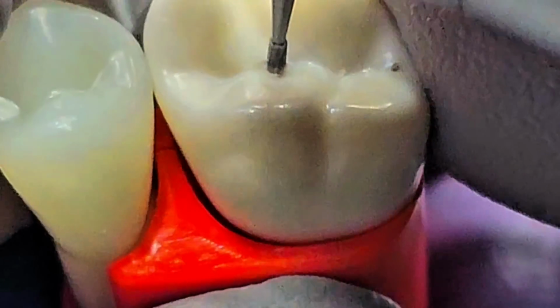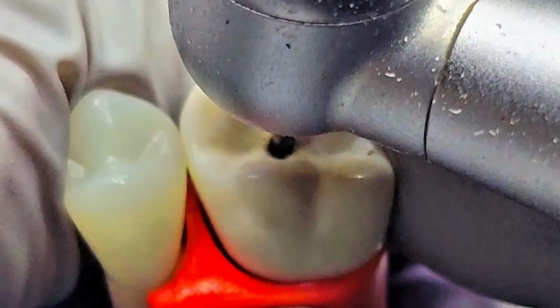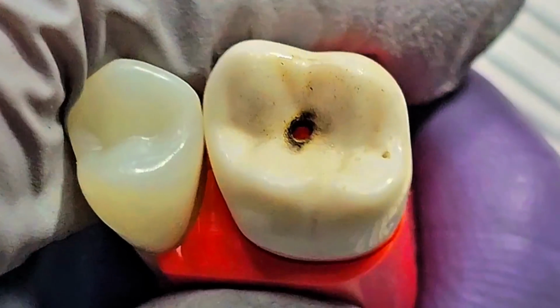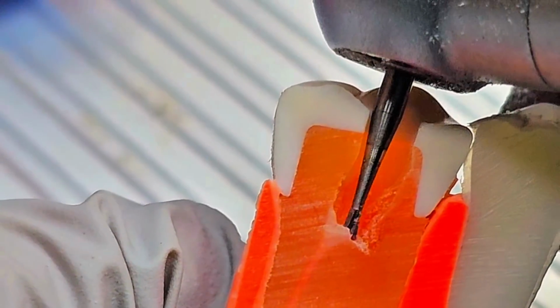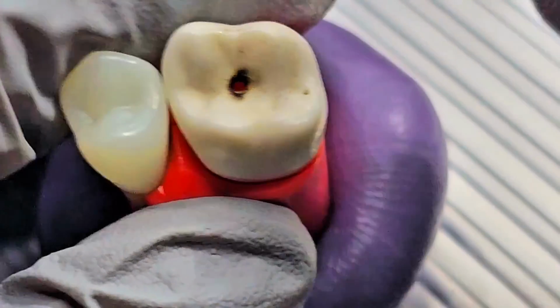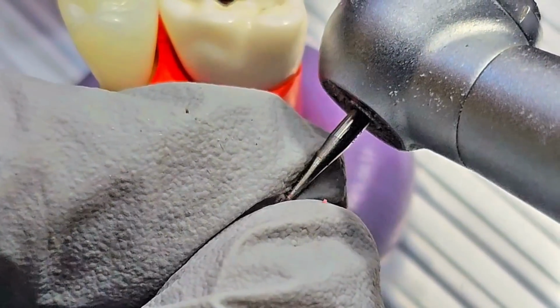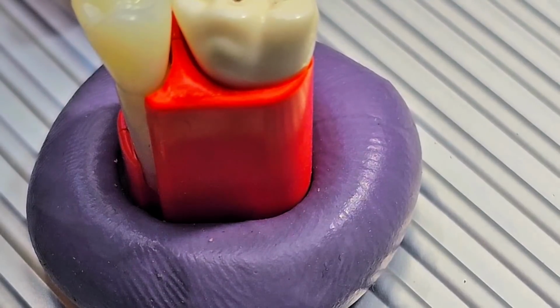So I'm going to drill. But don't go more than 7 millimeters, or you will hit the bottom. Now I'm here. Sorry that I'm using the 330 burr, because this burr is smaller than the shank, so it has a stop kind of. At this point, I'm going to change my burr.